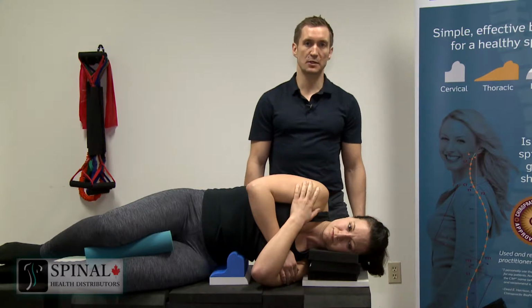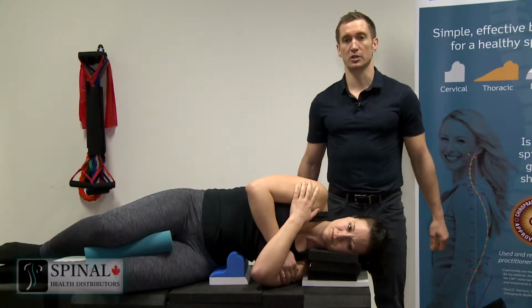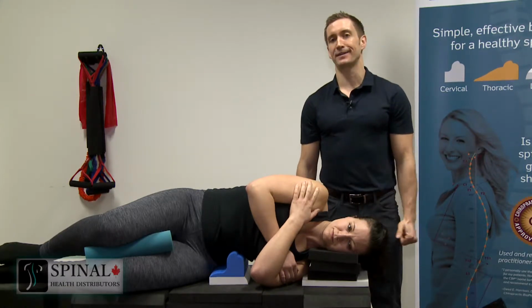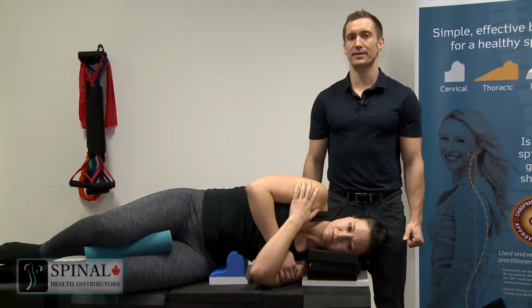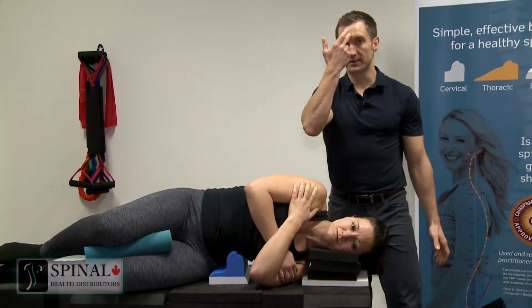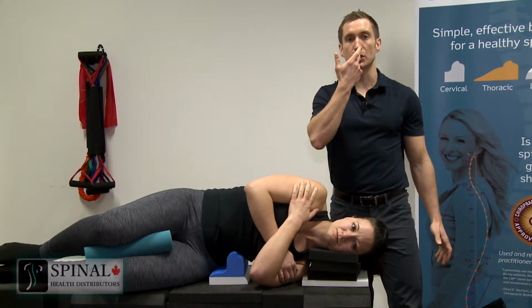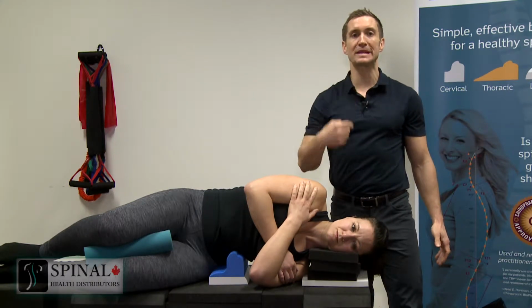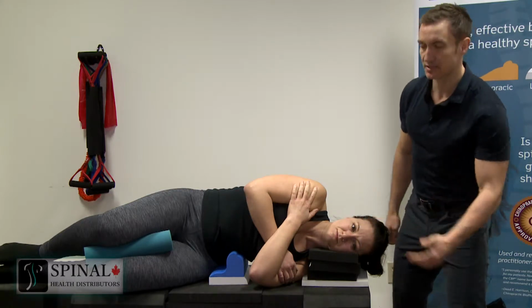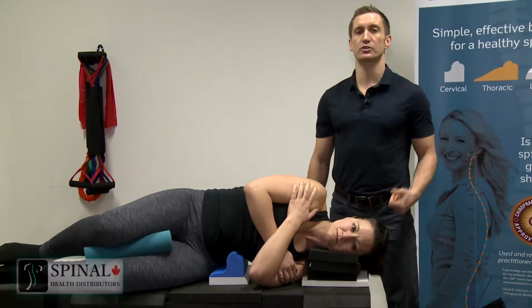Okay? Other things to pay attention for are the head position. If we have a fairly neutral head position, we want to protect this while the patient is lying on the Scoliroll. So in this instance, if we're looking for neutral head position, we want the middle of the eyebrows, the bridge of the nose, the top of the lip, all of that to be in line with the sternal notch. We look at our patient here and we can see that yes, the center of her face is in line with the sternal notch.